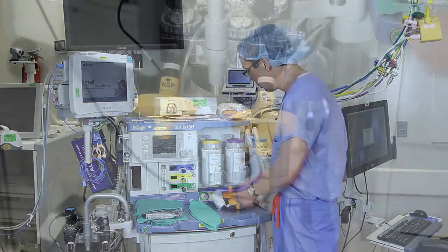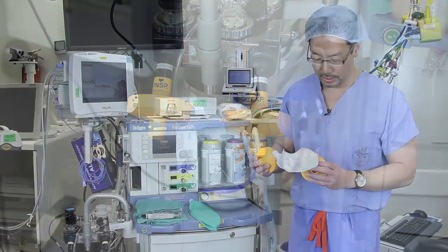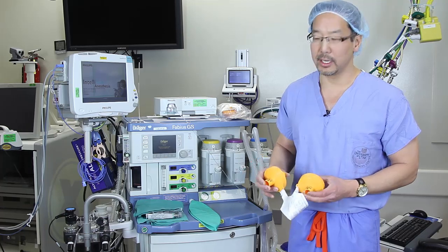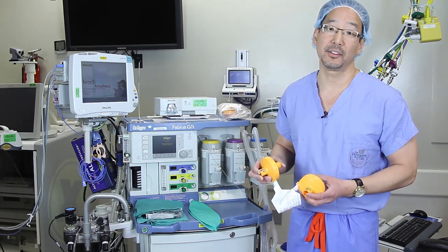The VaporClean is a new filter system that has been on the market since 2010. When using these filters, you can have your anesthesia machine ready for a susceptible MH patient in less than 90 seconds.